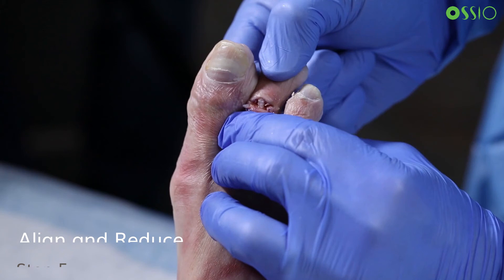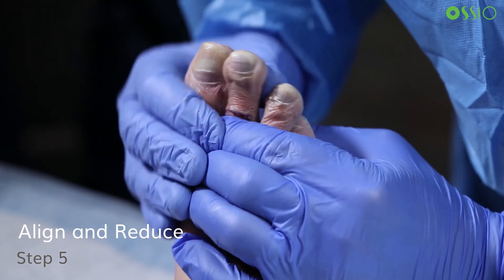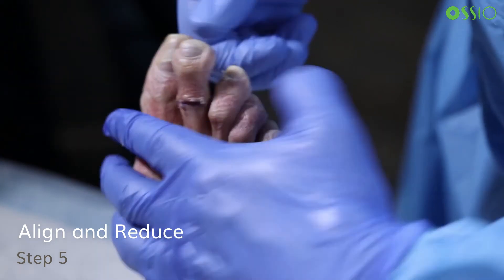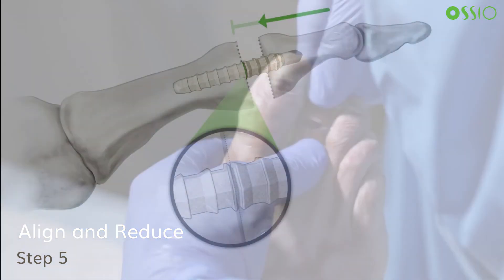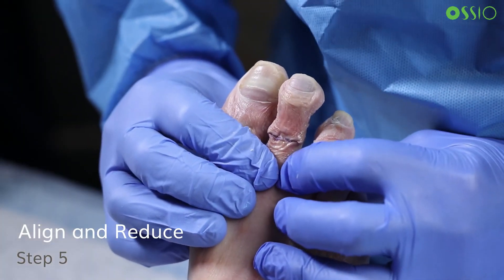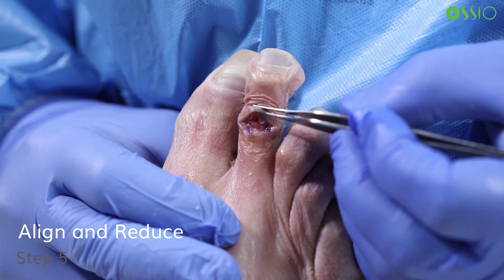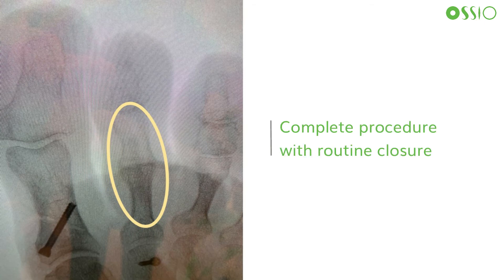Manually reduce the middle phalanx over the distal end of the implant, applying slow, steady pressure until bone to bone contact is achieved. The implant has barbs, not threads, so it is intended to be inserted into the middle phalanx linearly instead of being screwed in. Visually inspect the PIP fusion site to ensure appropriate bone contact is achieved; this can additionally be confirmed with fluoroscopic imaging. The procedure is then completed with routine closure using the surgeon's preferred technique.